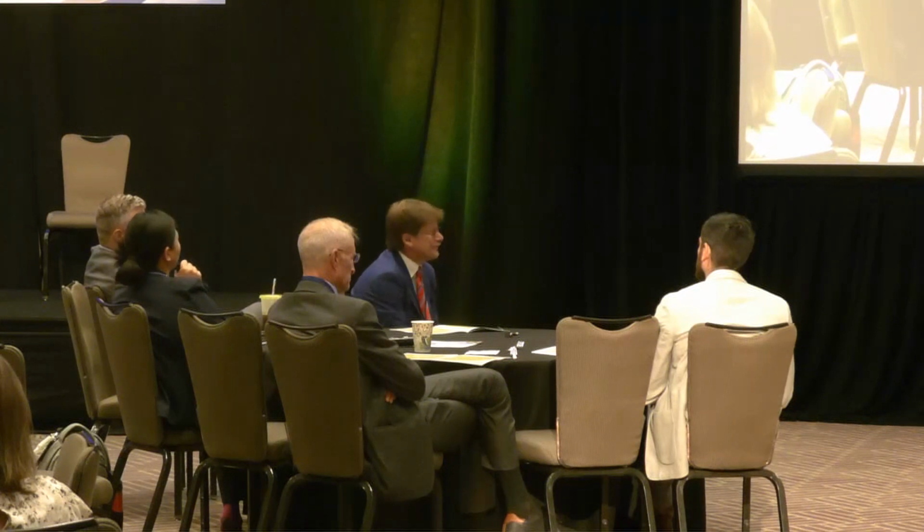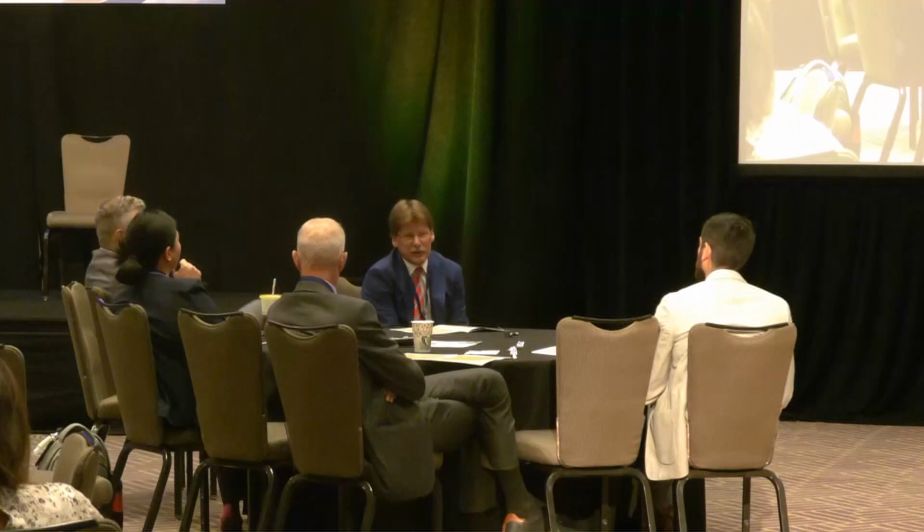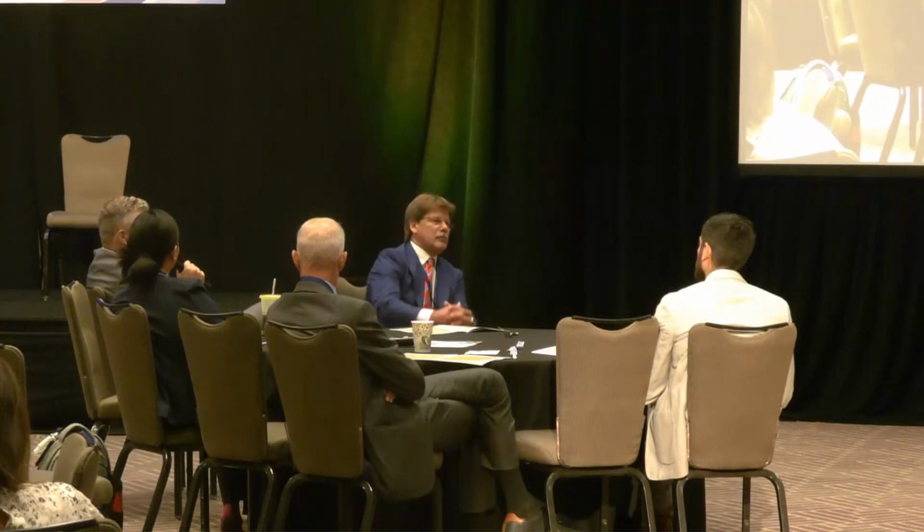I'm sorry, guys. Well, and you're also asking next to someone who knows more about how Supera stents behave than ever. There's the same concept about the fact that you're not just treating a vessel, you're treating that pathology of the stent fracture.